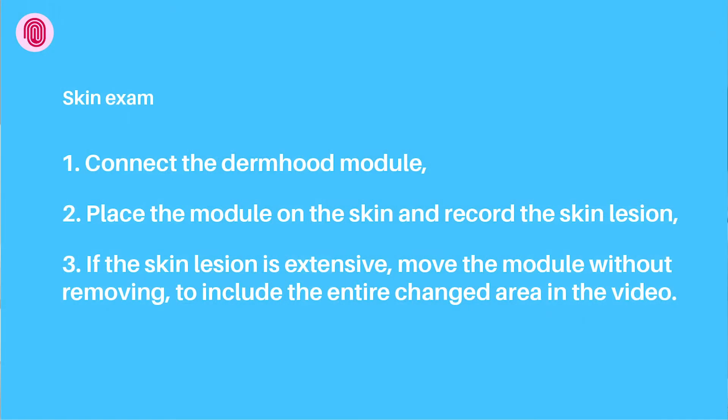Keep in mind these few steps to correctly perform the skin exam. Place the module firmly on the skin to block out external light. Remember to record the area surrounding the skin lesion for context.